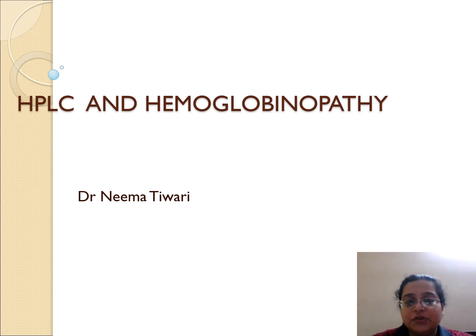So I had promised you that I'm going to take up some cases, some graphs of HPLC, so that you can get attuned to what an HPLC graph looks like. And I'm not teaching you the principles of HPLC as such, or how to plot a graph or make a graph. I'm just teaching you what part of the graph is read, and clinically, practically, what points are of use to you. Since the HPLC part is a little big, I am not giving you too much intro every time I give a small presentation on HPLC.